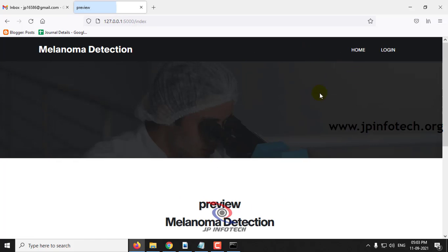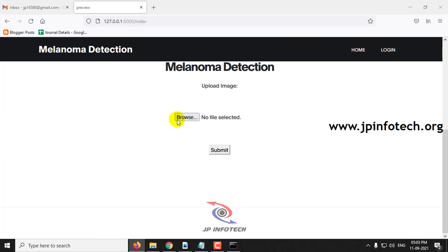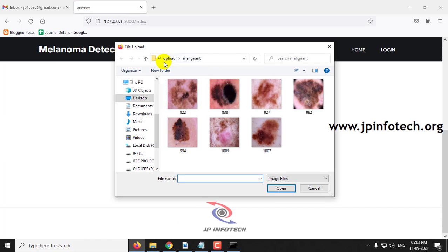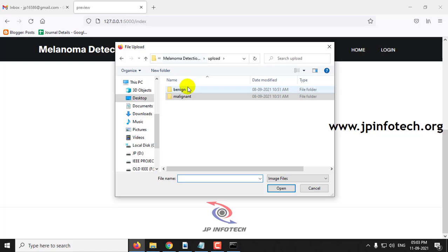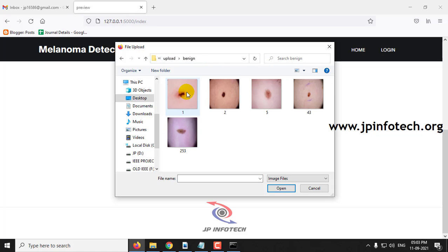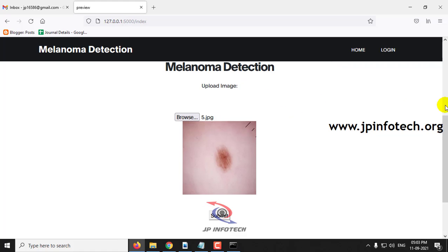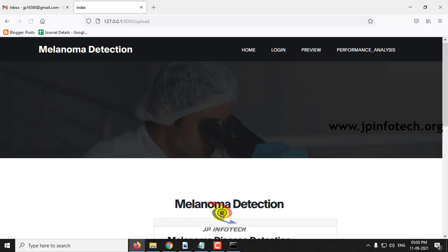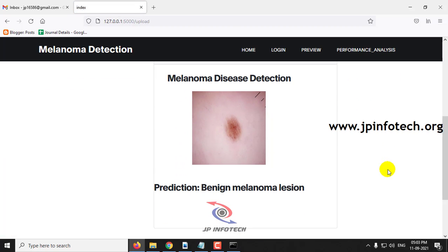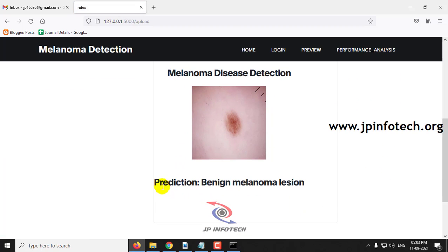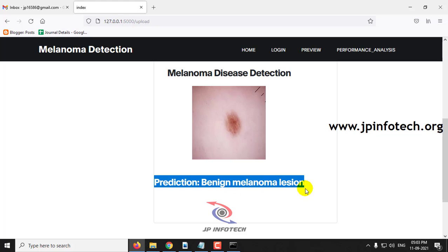Let me go to the preview part again and select an image from Benign, then click submit. Now you can see the prediction result is Benign melanoma lesion.